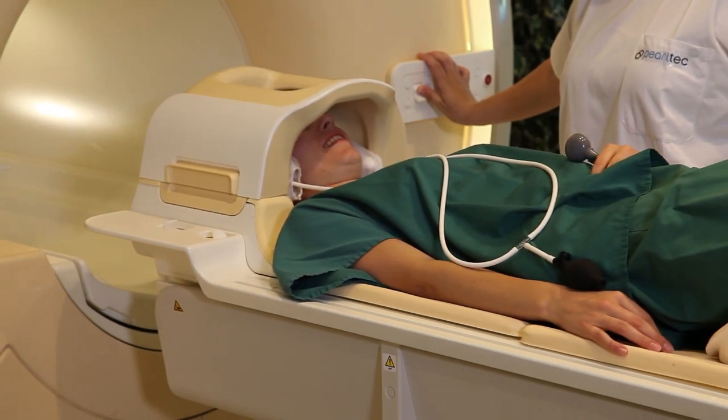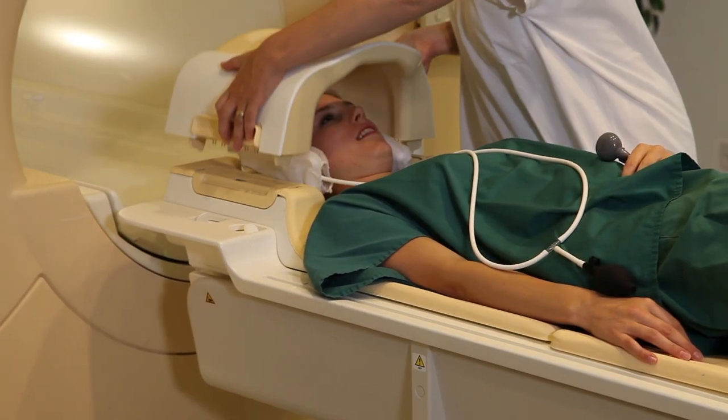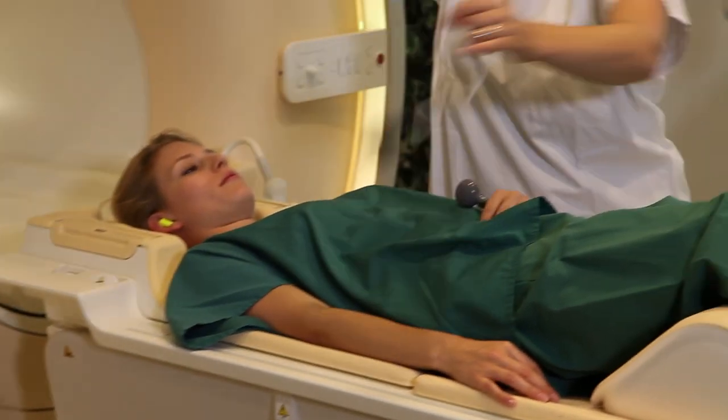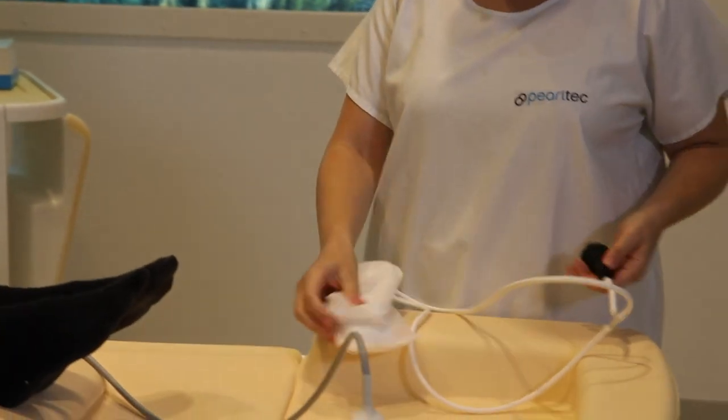When the examination is complete, simply release the pad pressure by pushing in on the air valve. Remove the pads and release the remaining air by pressing your hand on the pad while holding the air valve open.